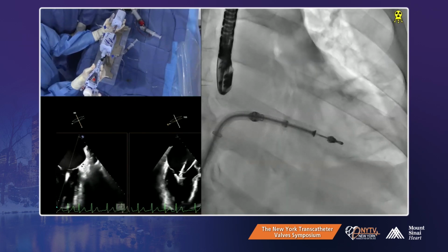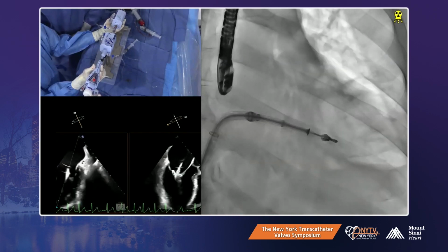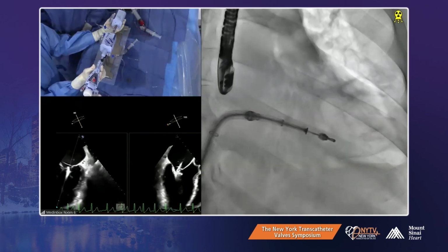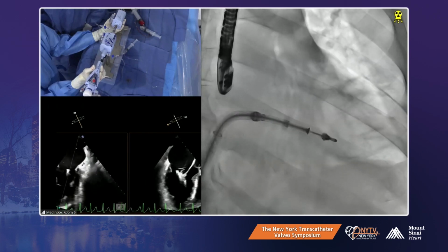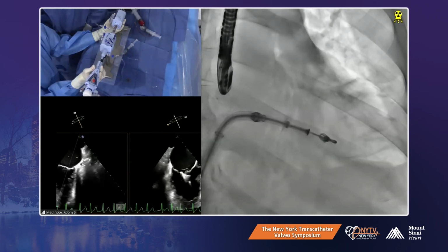You know what, let's get to anterior first, so we can optimize more posterior. Directional sheath. Of posterior. Okay, let's drop anterior. We're gonna drop anterior.